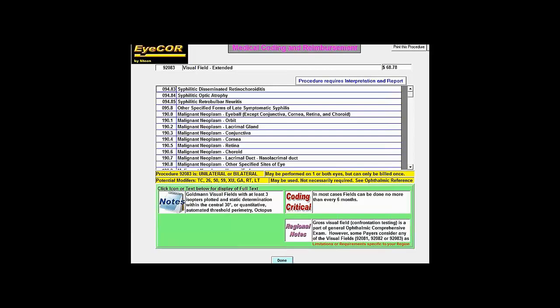And it is appropriate because even if you're not billing the procedure, it's not costing you all that much money. But for those cases where it actually shows you some indication, whether it's glaucoma suspect or some other issue with that device, now you can start billing that patient medically. And that's a significant increase in reimbursement. Because if you have a patient that's there only for refraction, you really want to move them into that medical mode and get that increased reimbursement.